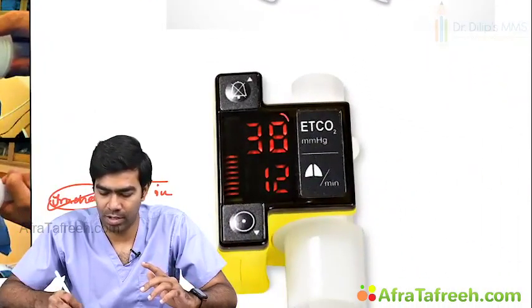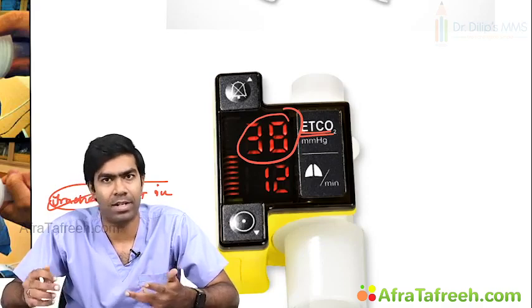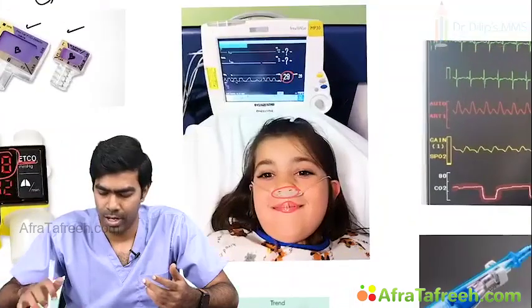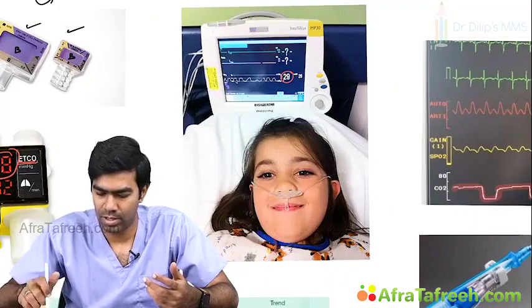And next you have this kind of quantitative EtCO2 monitoring only, without waveforms. This is a portable one which is usually carried by paramedics. It is not going to show the waveforms, only the EtCO2 value, right? And these are some of the other kinds of detectors as well. You can see here.